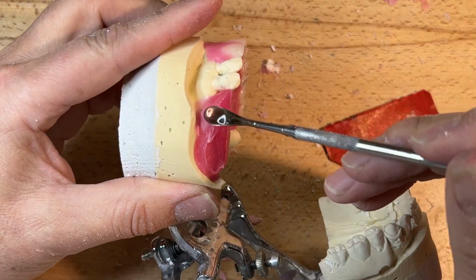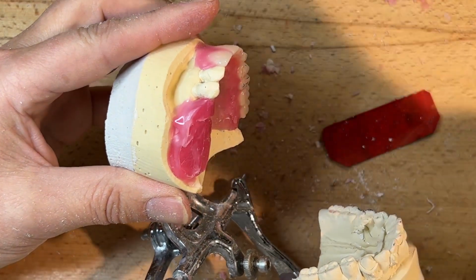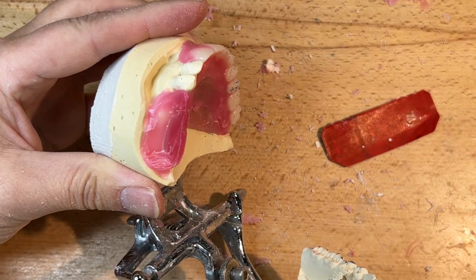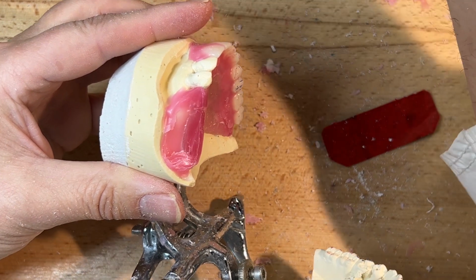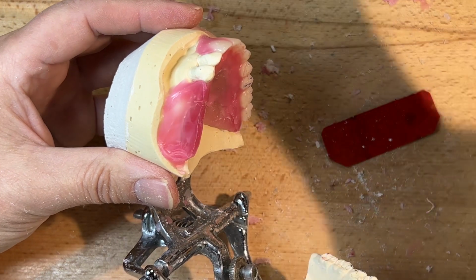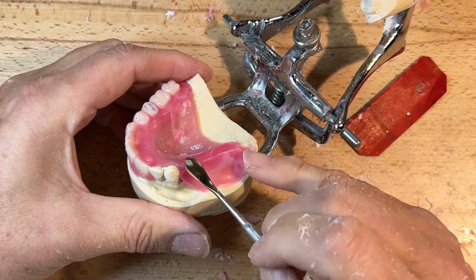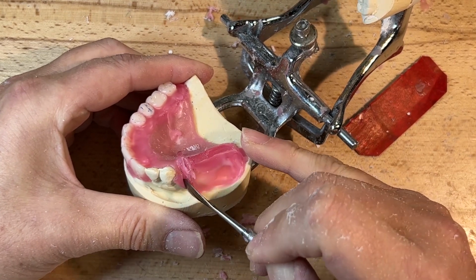Like I said, I didn't have the luxury of doing this case before. If we always do every case twice, you always change something, and the second time you go, oh, you know what I should have done? We can always be better, right? You have the experience of doing it. But this is kind of maybe a disadvantage to the dental technician. Every case is the first time. Every case is the first time facing this type of occlusion, this type of tooth mold, this shade, this vertical dimension. And this is maybe what I believe makes the job hard.